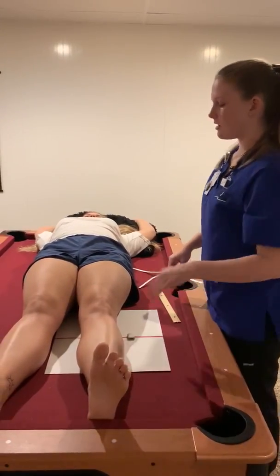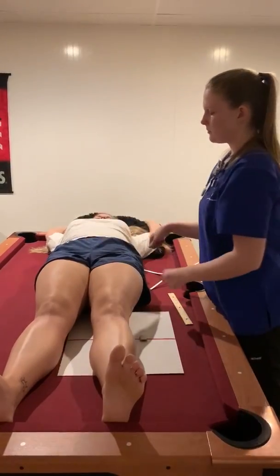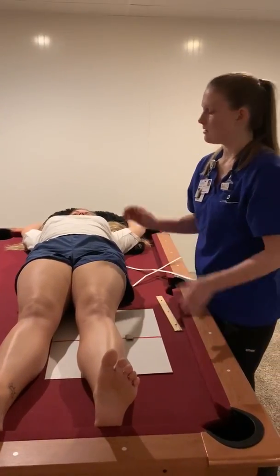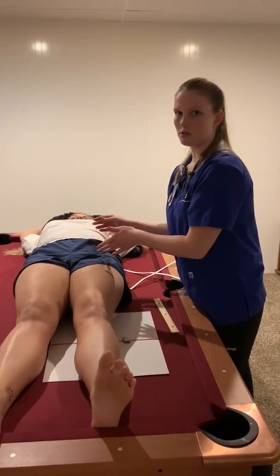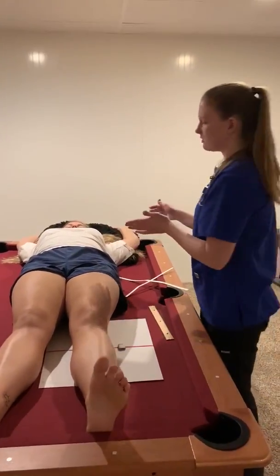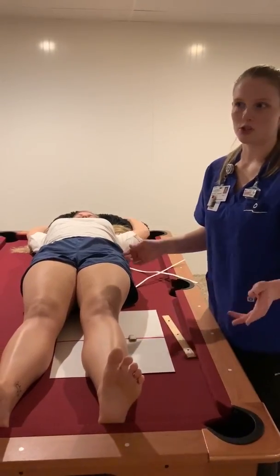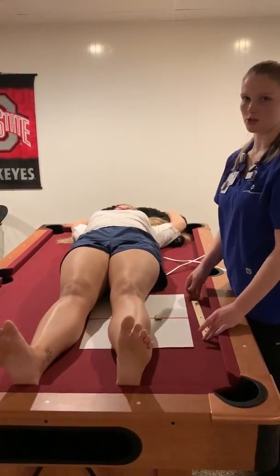So then I would grab a shield and place the shield over her lap, because for this one you can shield, unlike the pelvis, where in females the gonads are within the pelvis region, so you can't really shield there. But if I had a shield, I would have shielded her breast tissue or her upper femurs. But since I don't have a shield for the knee, I would just place it over her gonadal region.